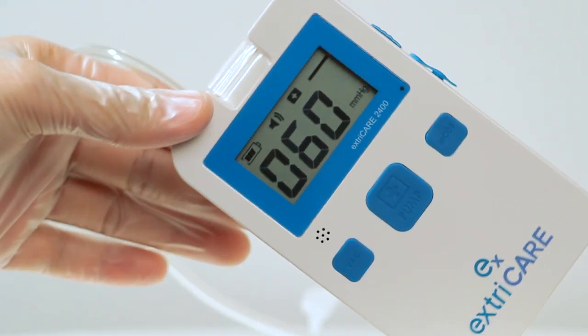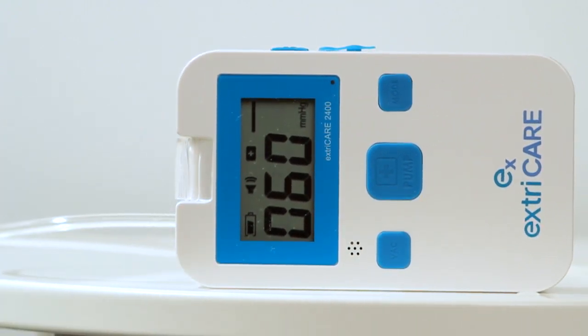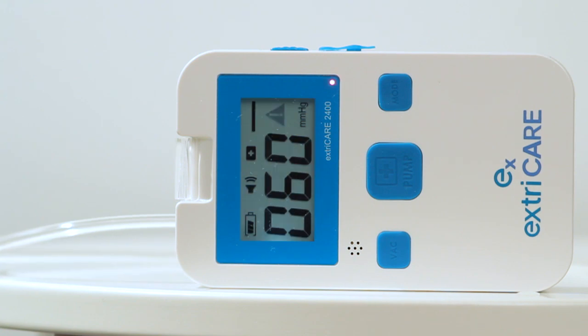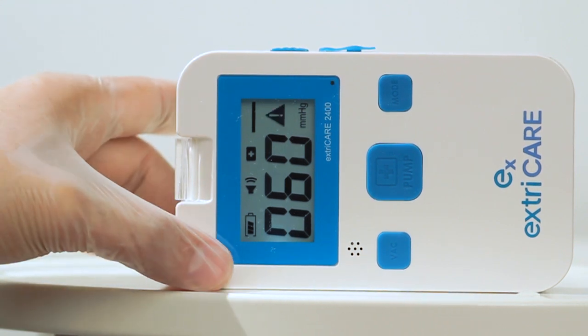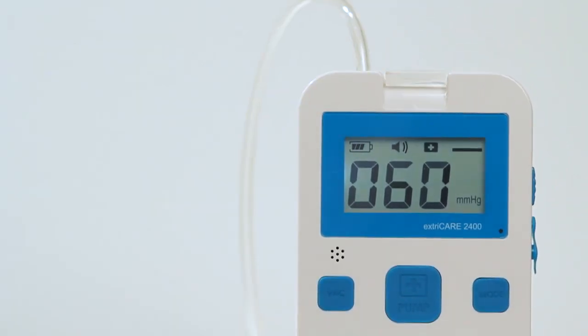If the ExtraCare is tilted more than 45 degrees for over 10 seconds, the device will sound an alarm and the red LED light will flash. If the device is tilted for more than 1 minute, it will stop operating. The system will not start up again until it is placed vertically for 3 seconds.